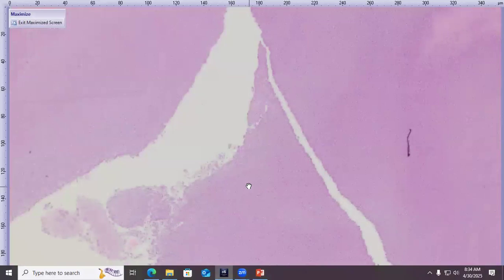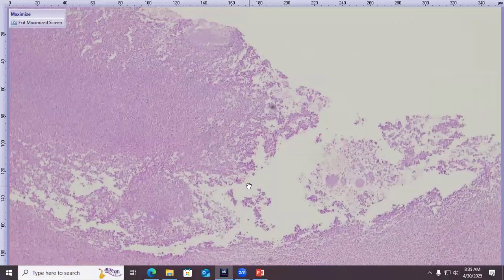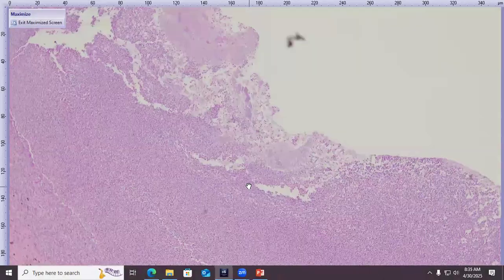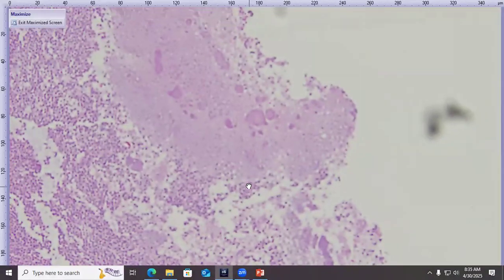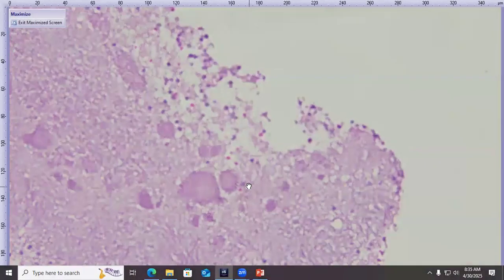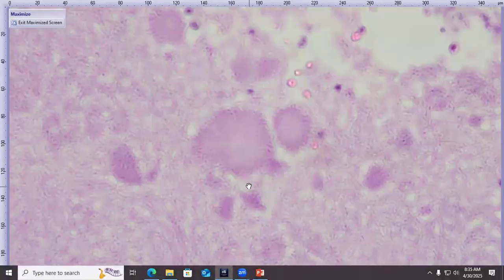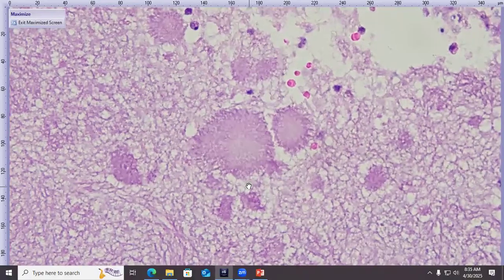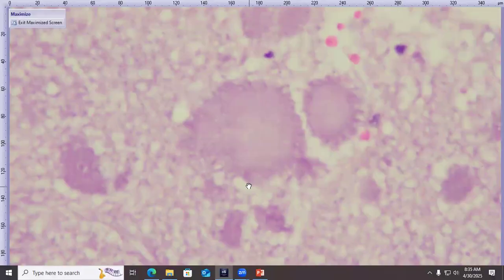If we look around in this abscess, we find some interesting things, which those may or may not be the ones I'm looking for. Hold, please. There we go. I like these ones.